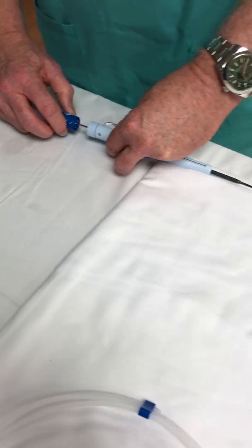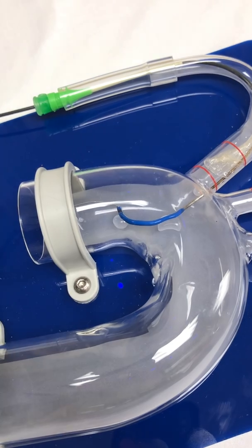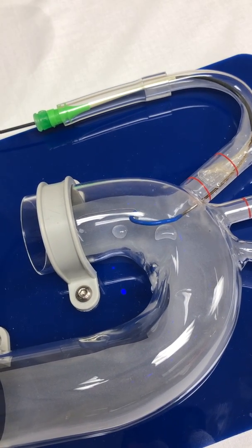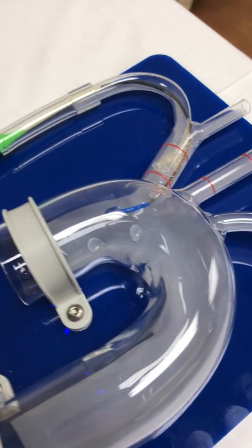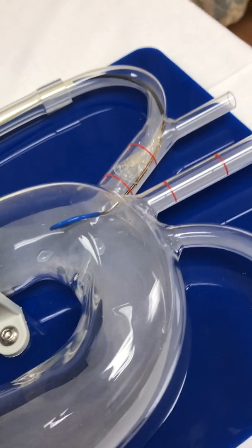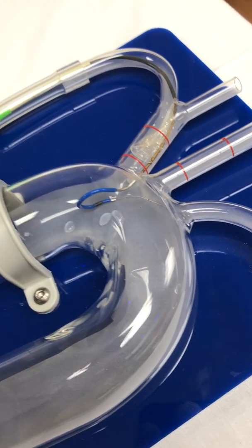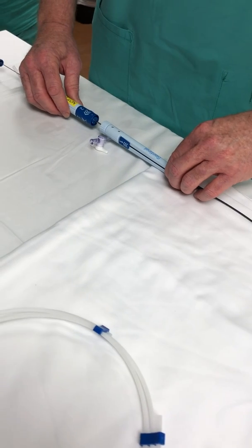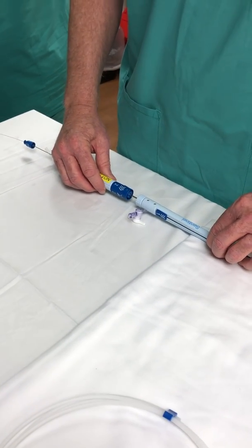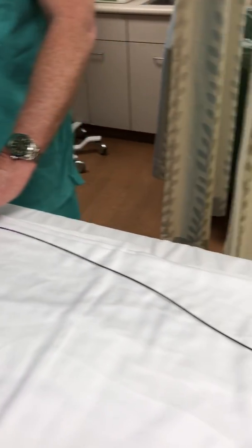You're going to go one way, then turn and keep curving it. Once we've taken an aortogram and know where that left common is, and our ACT is 250 — always when we put this device in and until we take it out — we're turning the entire device for AP rotation, and number two gives you the curve on the catheter.